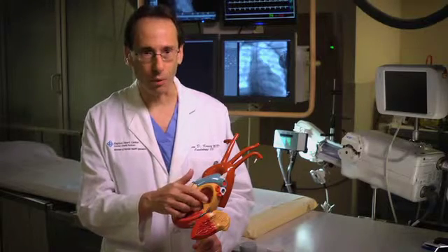Cryoballoon ablation is a newer technique to cure atrial fibrillation through ablation. The traditional ablation system would use a catheter to burn points in the heart muscle around the veins in the heart where atrial fibrillation would come from. That would be a long process, very tedious when you're burning point to point.